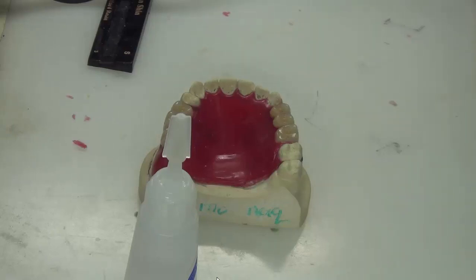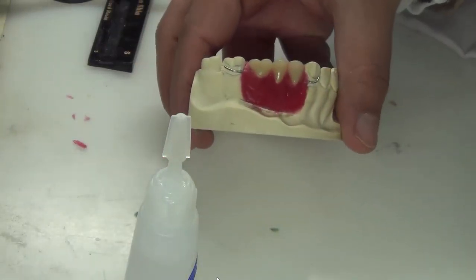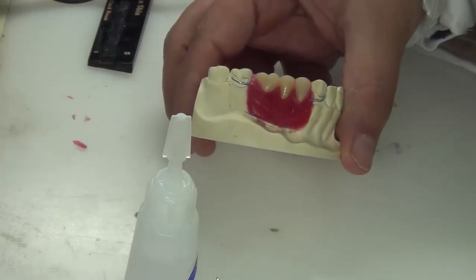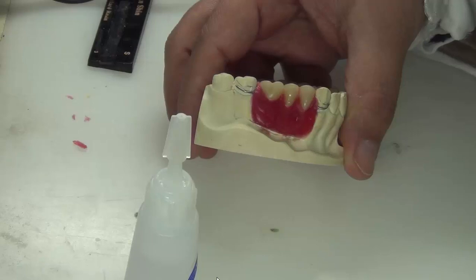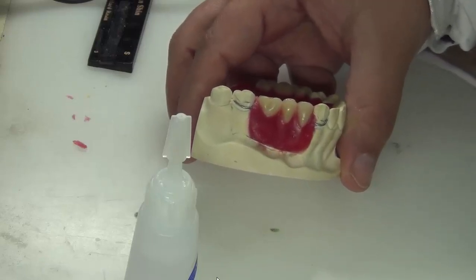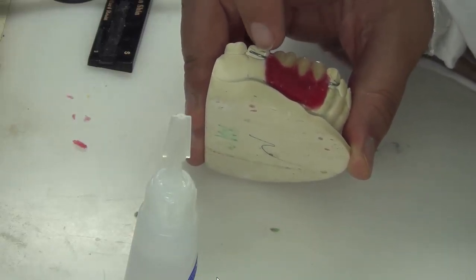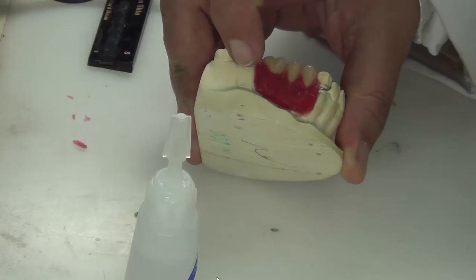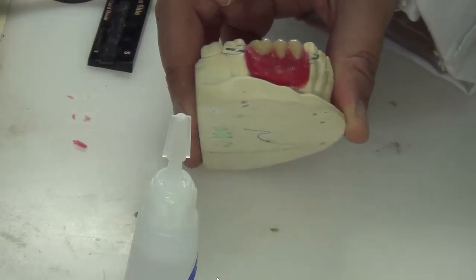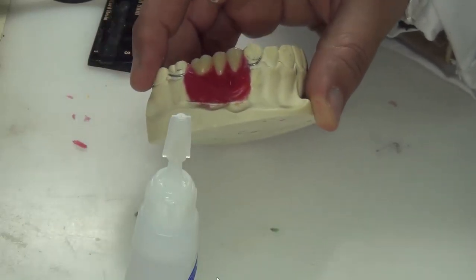Then we need also to make sure that the clasps are still in location. Remember, some of you, while adding teeth, the clasps rotated. So they became touching the gingiva. So we don't want that, okay? So make sure that your clasps are in the correct location under the survey line, above the marginal gingiva, and we have a space between it and the marginal gingiva of around 1 to 2 millimeters, okay? So it's not touching the gingiva.